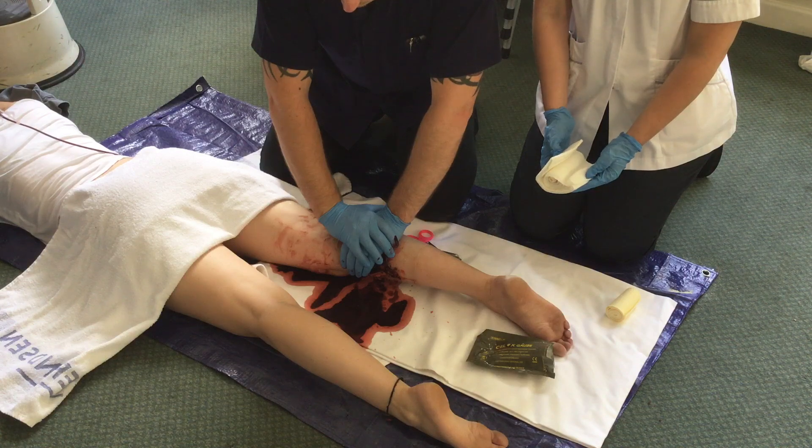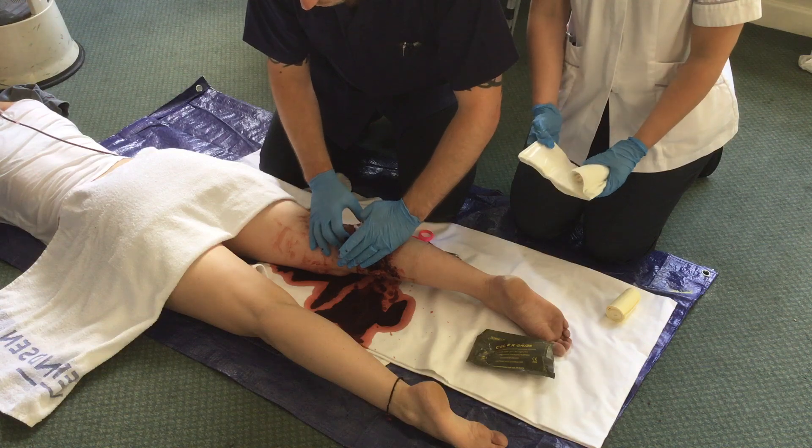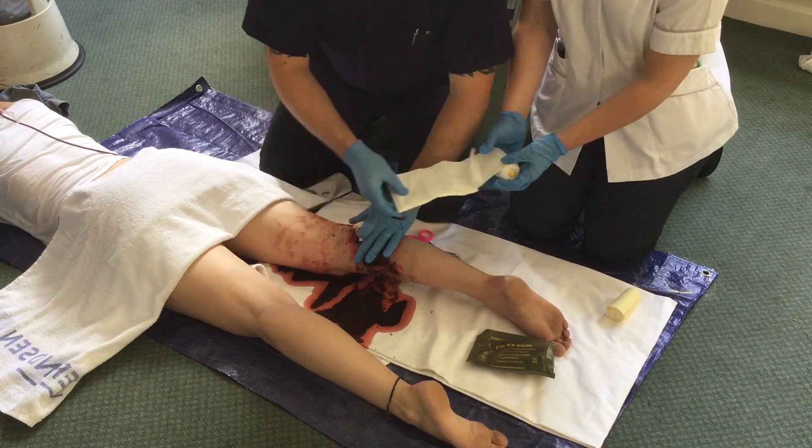At the end of five minutes the wound is inspected. If hemorrhage has ceased, a field dressing is applied and the patient is then evacuated.